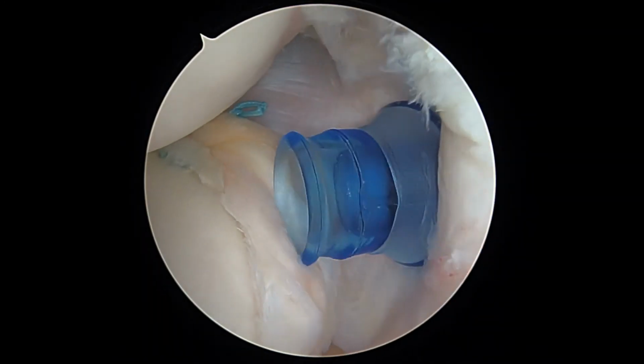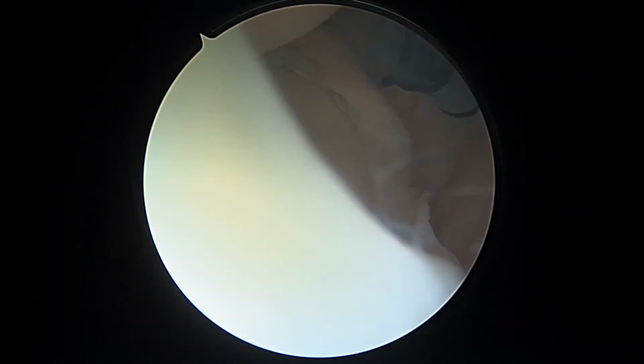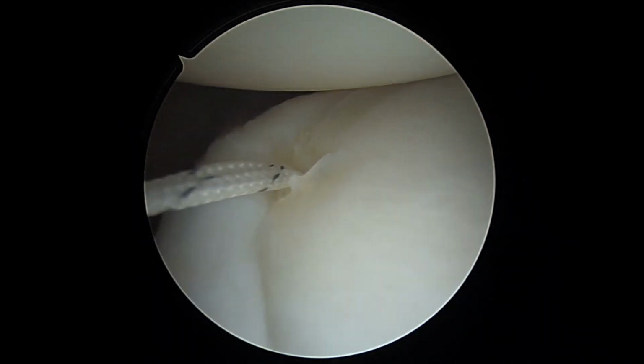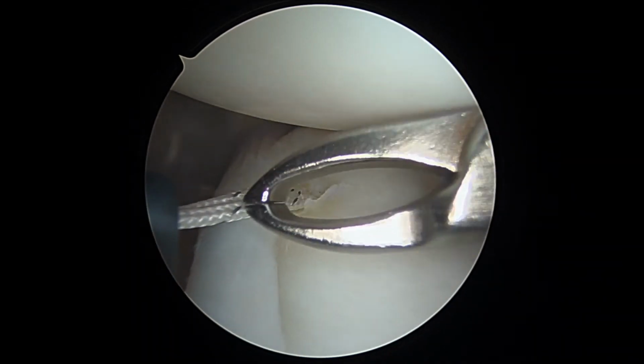Because of the way we're set up, we don't have to move the scope. We just now have to work through the cannula on the left. I'm going to slip around behind the biceps, make sure I'm behind it, just to give me room to work. That looks good. So the next step is to go ahead and place another suture anchor down low in the front. Okay, so you can see our anchor in the front here. It's black and white stripe, but basically the same type of suture, just different color.